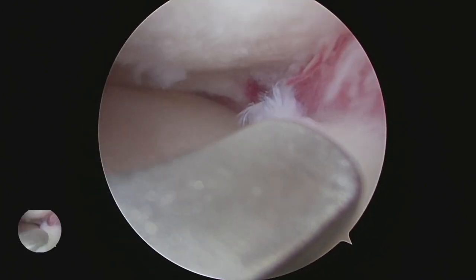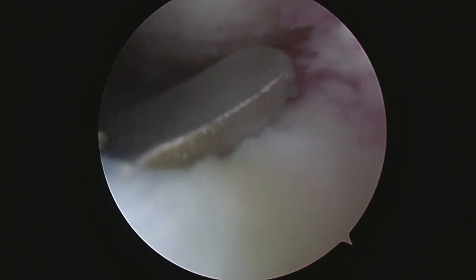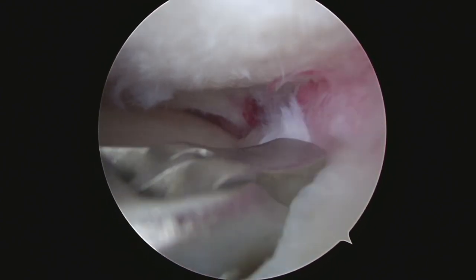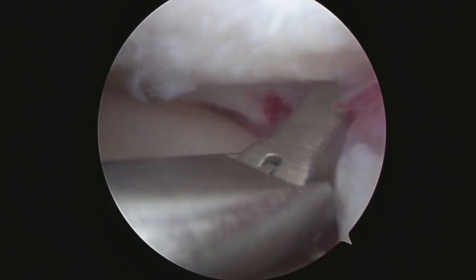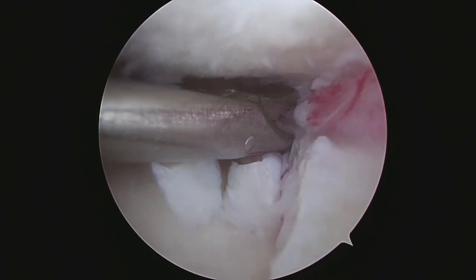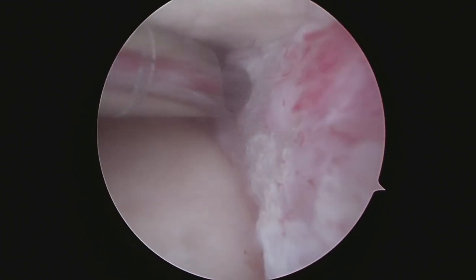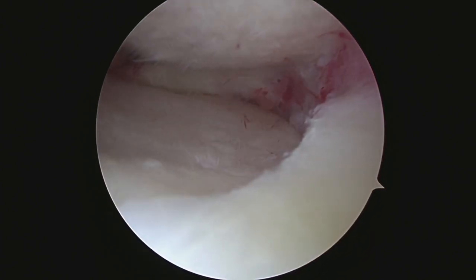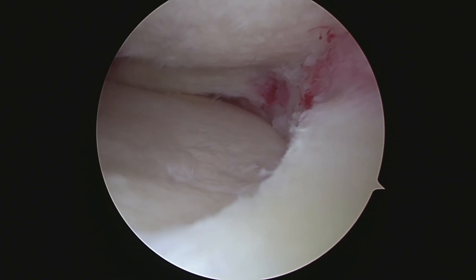Okay Roselle, I'm looking from the other portal now, and I'm connecting the dots. You could see from your anterior horn to the mid-zone where your meniscus tear goes all the way to your capsule. So I'm resecting this back all the way to the apex of the tear where you could see it's all the way to the capsule. Making a nice smooth transition - you can see it starting to get to that point. Just cleaning up a little more here with the shaver. This looks good here Roselle from the one portal. We're going to switch portals one more time and take a look from the other side and make sure.